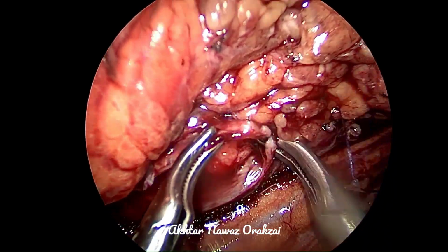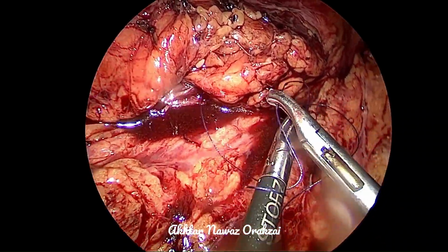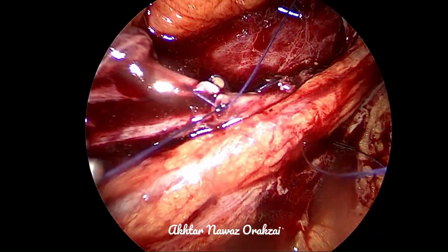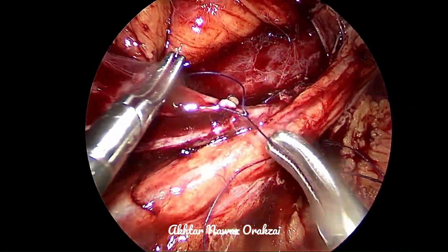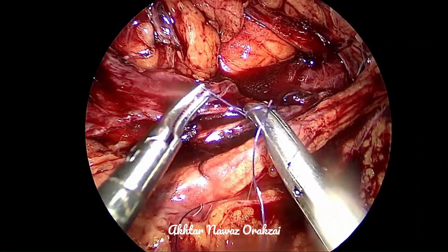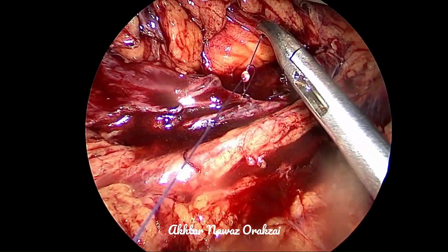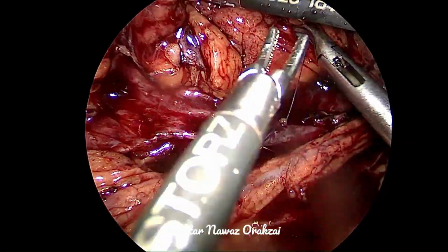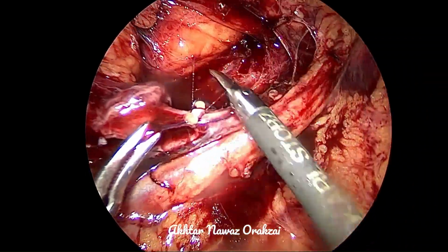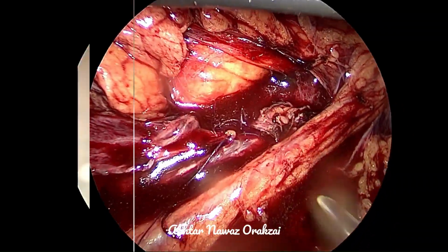So I usually take the first stitch before placing the DJ stent, because once we place a DJ stent, it may be a little difficult to place this stitch. However, it again is a personal preference. Those who want to place the DJ first and then do the stitch, they have their own points.